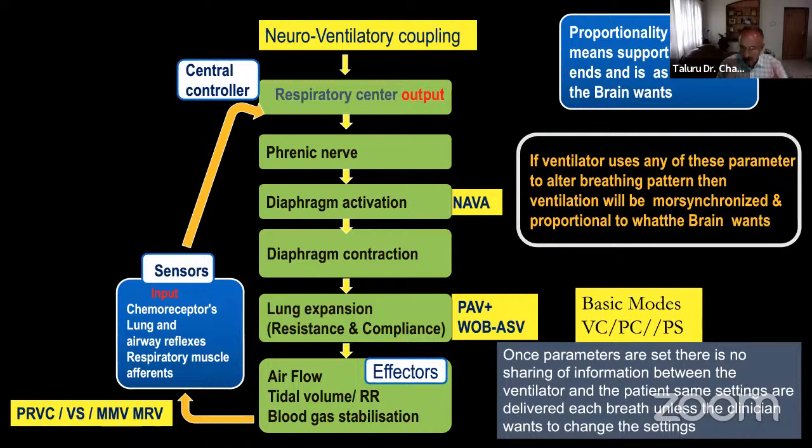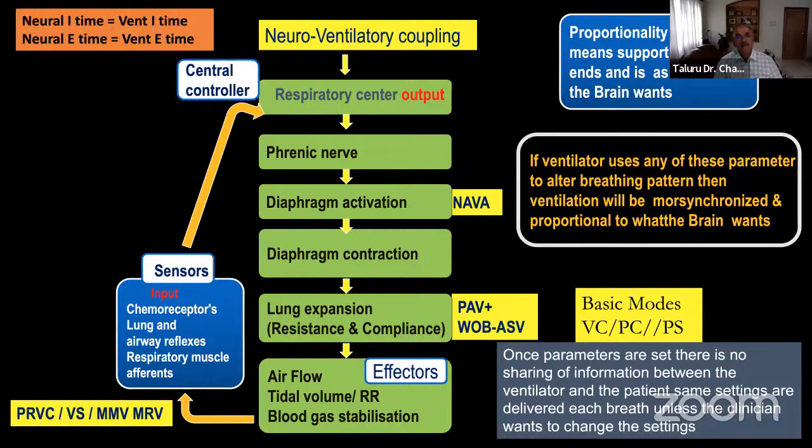But as an anesthesiologist, my submission is, because the patient is paralyzed, there is no interaction, all the workload is being done by a ventilator, you don't require to look anything beyond a volume control most of the times, pressure control, and as the applications of pressure support comes, looking at pressure support. In fact, all the three modes can be applied to all the patients, however sick he is, if you know the physiology and the science behind modes of ventilation.